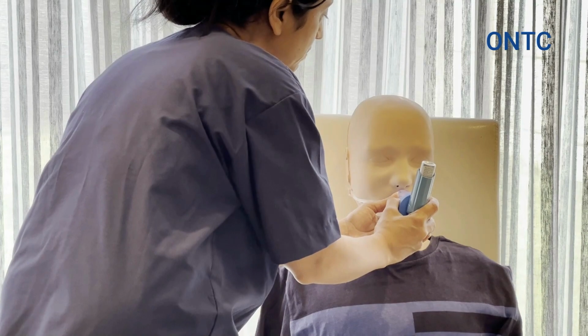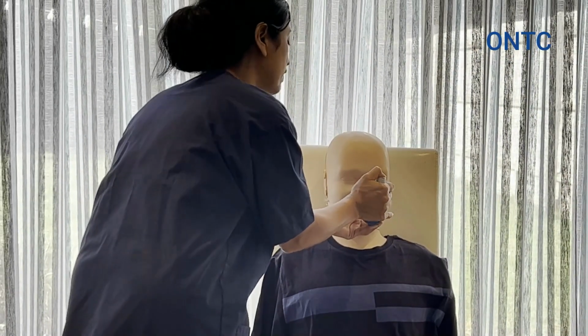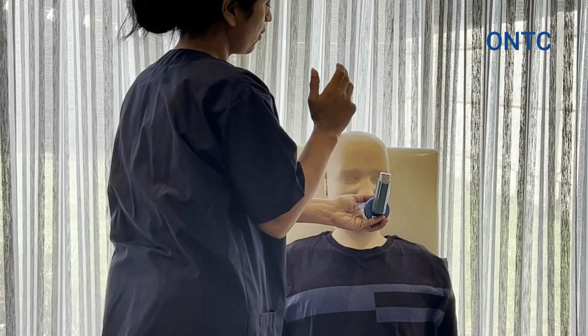Okay, you started breathing deeply in and out. Now tip your head back. Yeah, you tipped your head back. I'm just going to give you your first dose. Right, keep breathing in and out 5 times. So 1, 2, 3, 4, 5.